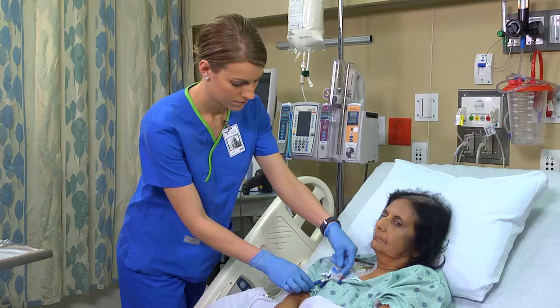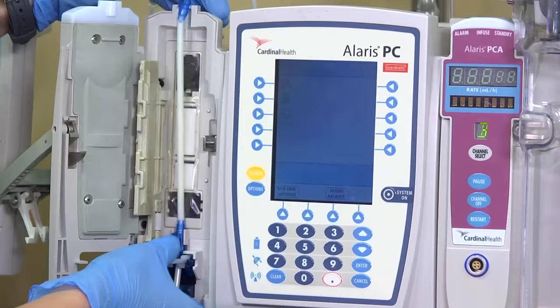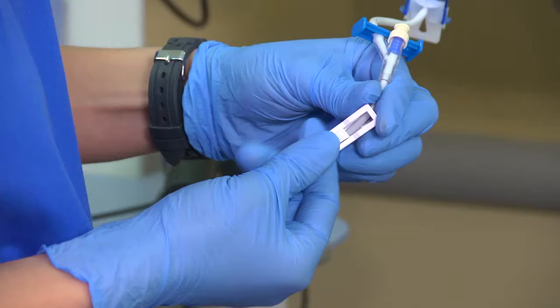All right, now I'm going to hook it into the infusion pump. Open the roller clamp to a rate that maintains the patency of the line. Next, connect the tubing to an IV infusion pump. Open the roller clamp completely and regulate the flow rate as ordered.